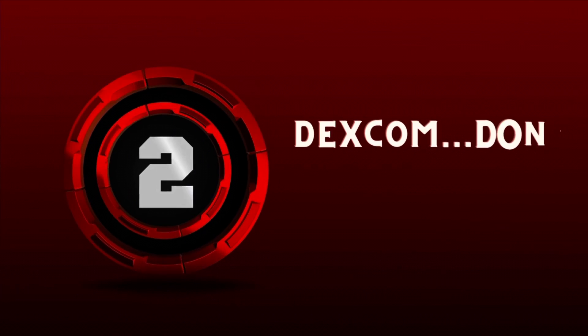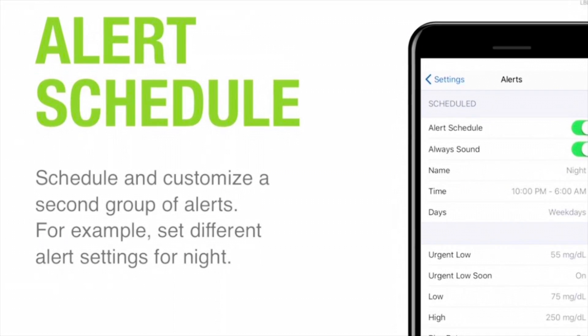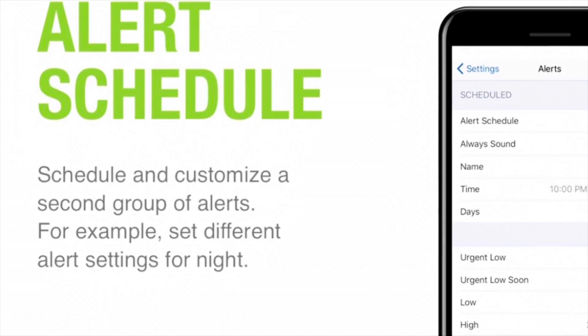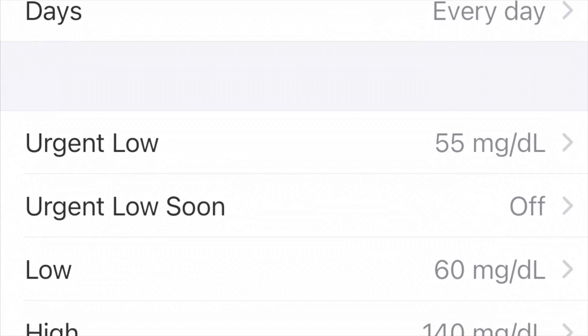Number two: Dexcom, don't bother me now. With the Dexcom, unlike other CGMs I've used, you can set profiles for different parts of the day to control when you want Dexcom to alert you. For me, at night I'm more lax about what blood sugars I want to be woken up for — I let the high threshold creep up to about 160. During the day I have a separate profile where I'm more aggressive with corrections and want to know even if my threshold breaks 140 so I can correct it right away.